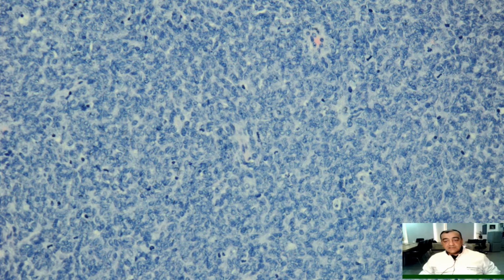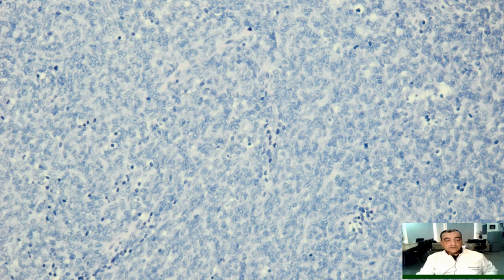Here you can see the medium-powered view of the tumor excised from a 12-year-old male patient who presented with a scapular neoplastic lesion. And here we can see the diffuse growth, a solid sheet-like growth of the tumor cells consisting of medium to small-sized blue round nuclei with narrow cytoplasm. We can see a lot of atypical mitoses, some scattered lymphocytes, and of course individual tumor cells with apoptotic changes.